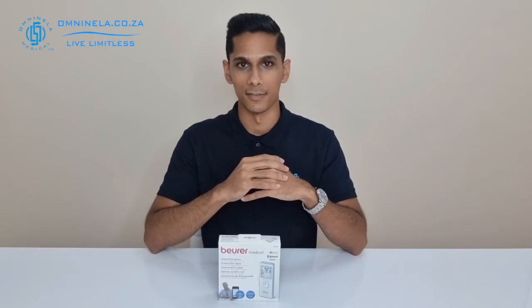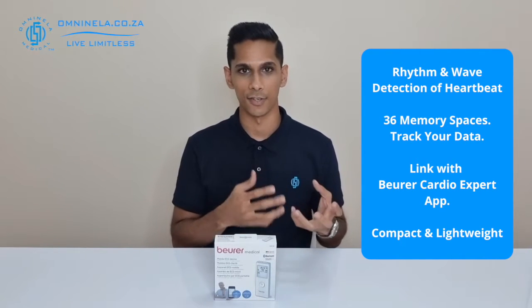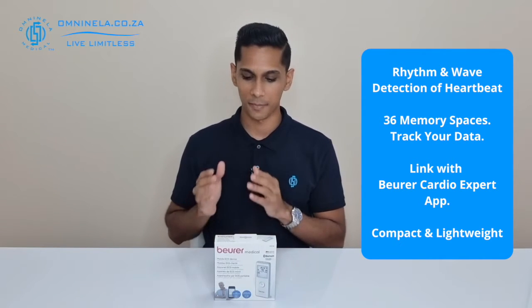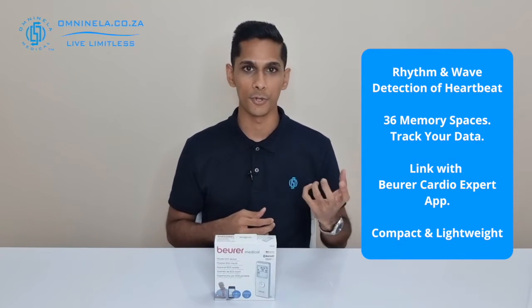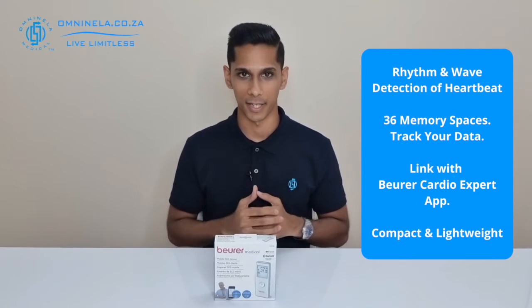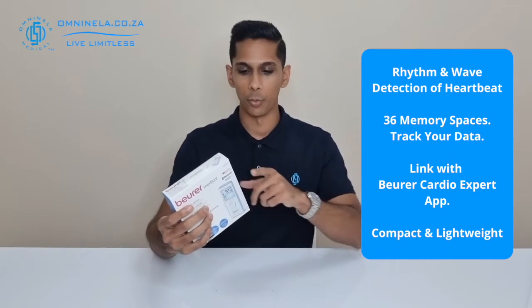So that you can figure out if this will be a suitable device for you. Having a look at some of the features noted on the outside of the box, we can see that the ME90 is primarily for rhythm and wave detection of your heartbeat — so it detects arrhythmias and also any varied waveforms in your heartbeat. The device also comes with 36 memory spaces, and if you need to export these you can do so via Bluetooth to your smartphone or USB cable to your computer, both of which use the Beurer Cardio Expert application.